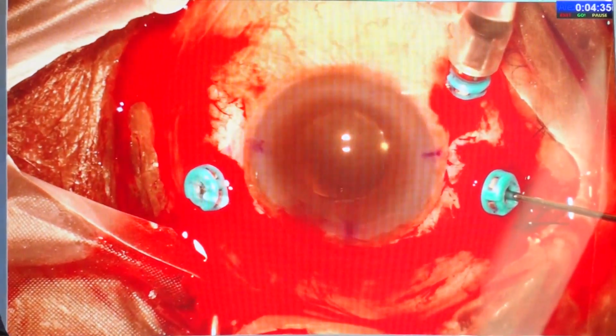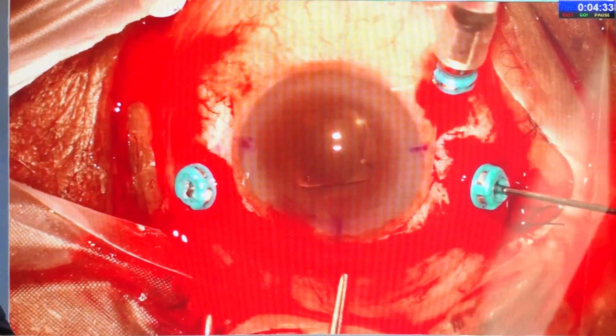When we just pull it and fish it out from the anterior side without removing all the tractions, there will be vitreoretinal traction, and in future the patient might develop complications. So we need to free the lens completely. Once the lens is free, it will fall freely into the vitreous cavity. I place a PFCL bubble to prevent any macular injuries, and then we can bring the IOL into the anterior chamber and explant it via a clear corneal or a sclerocorneal route.